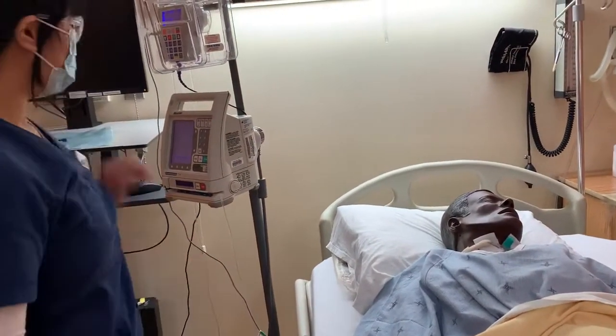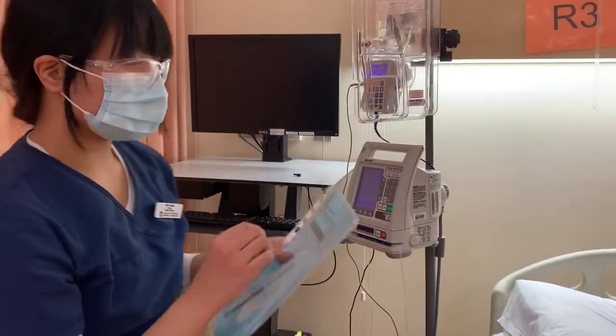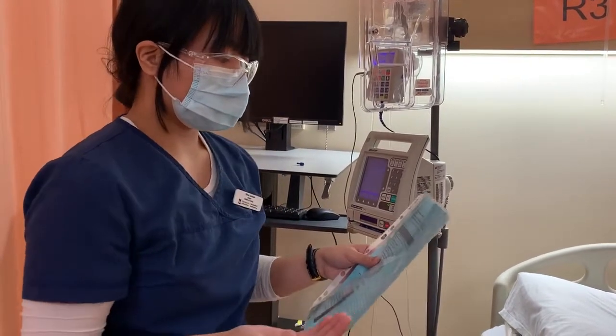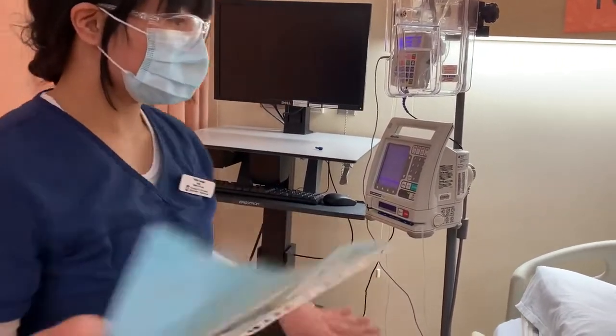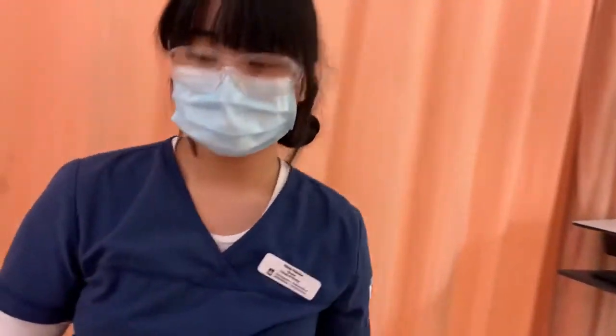Okay, so I will be documenting on my MAR as well. So I'm going to put the initiation time, as well as my buddy nurse or my second nurse will be co-signing in there as well. And then I'll do my safety check, patient's not in distress, bed's in the lowest position, no safety hazards, and I will exit.